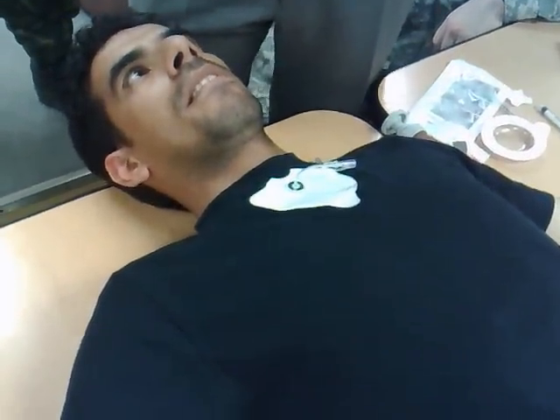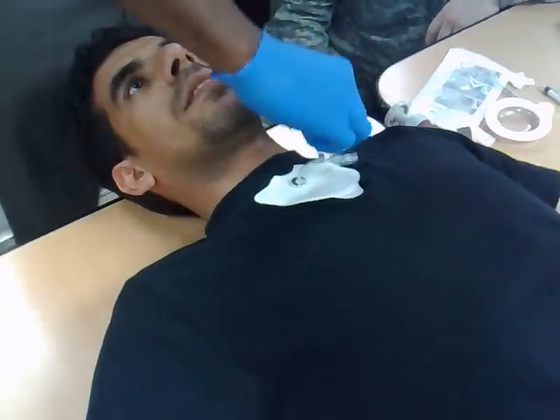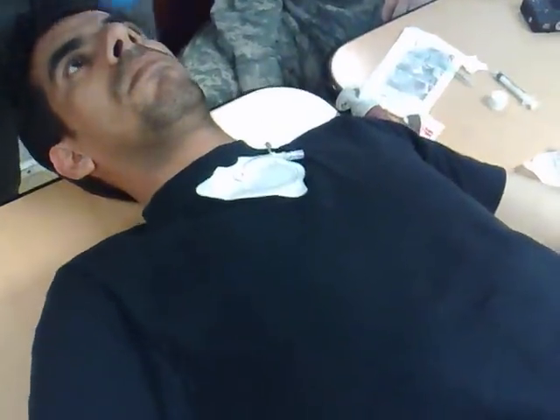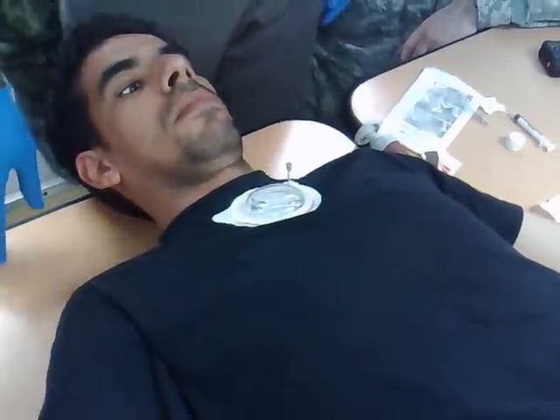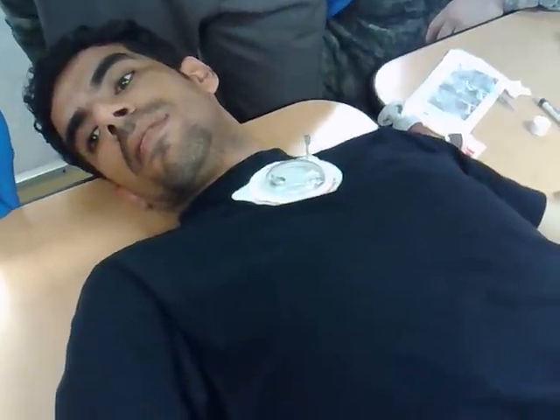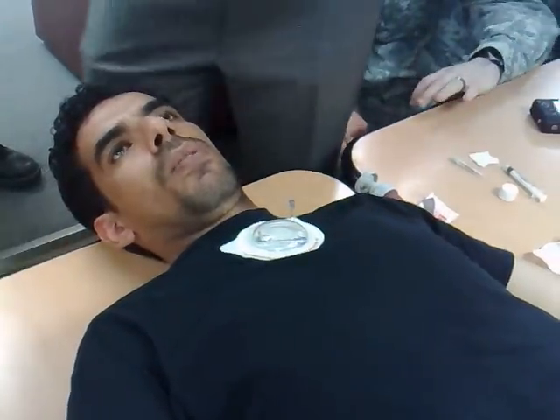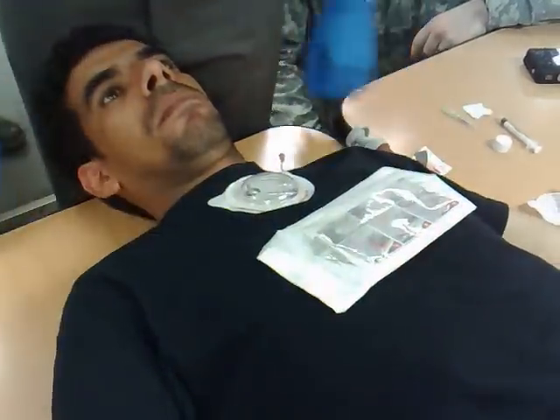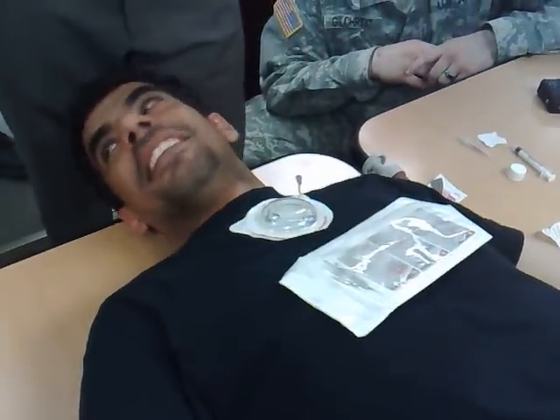Normally we would have IV and solution set up, but since we were demoing this for you guys, we're not gonna push fluids. After you flush, you're gonna get your IV line, go ahead and connect it up, then take your dome — your protective dome — and cover the top. Since we're working with an old FAST-1, it has a removal tool. When you're finished with this procedure, make sure you take your FAST-1 and tape it to the patient's chest — it's gonna go with the patient. If you're using an old one, once they get to the MTF, if they don't have one of these, they won't be able to take it out. The new ones don't require the removal tool.